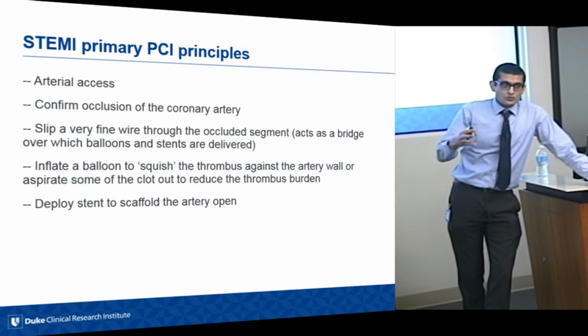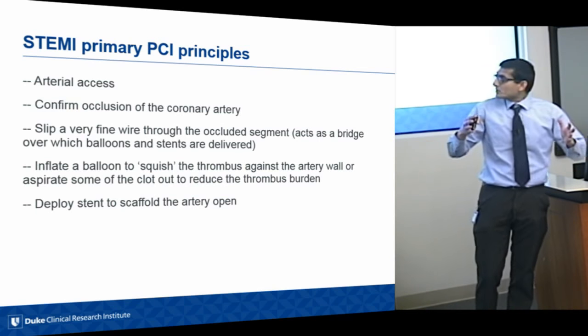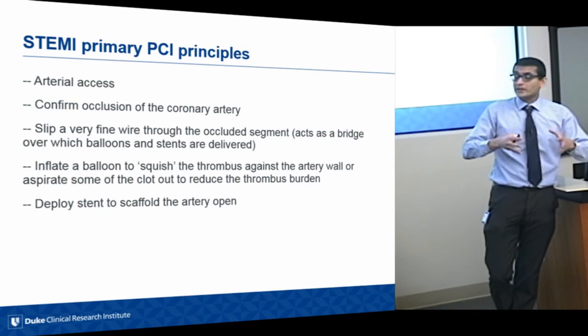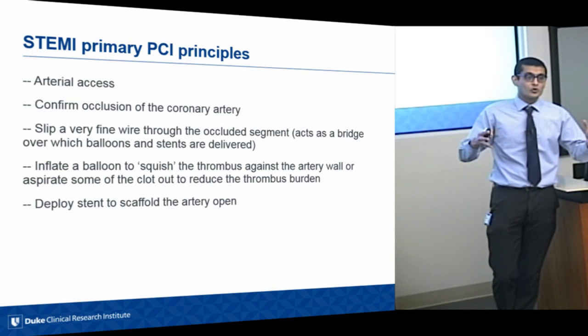We inflate a balloon to gently squish that thrombus against the arterial wall and open a channel, and then deploy a stent to keep that artery open.